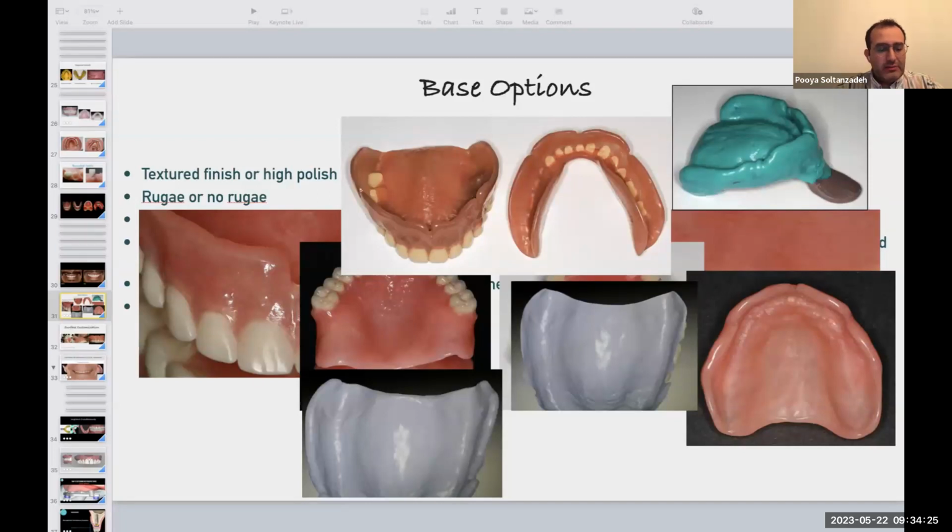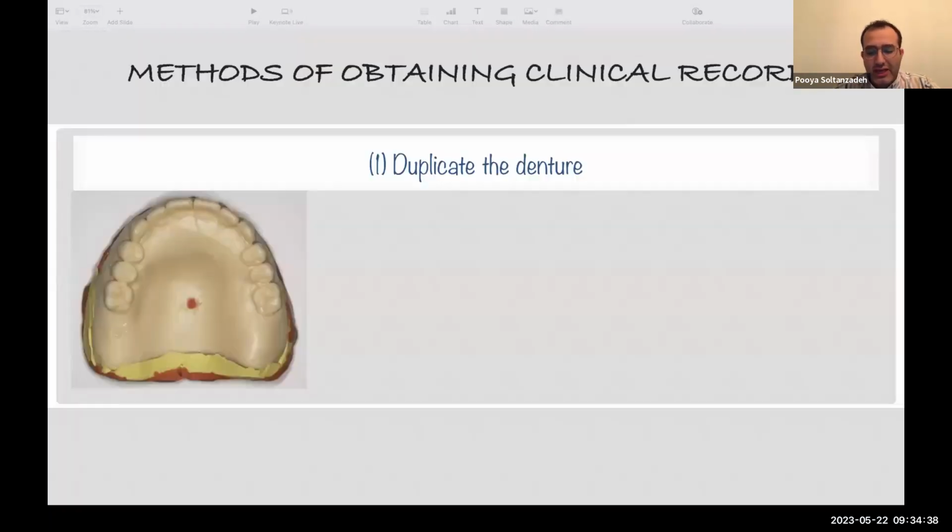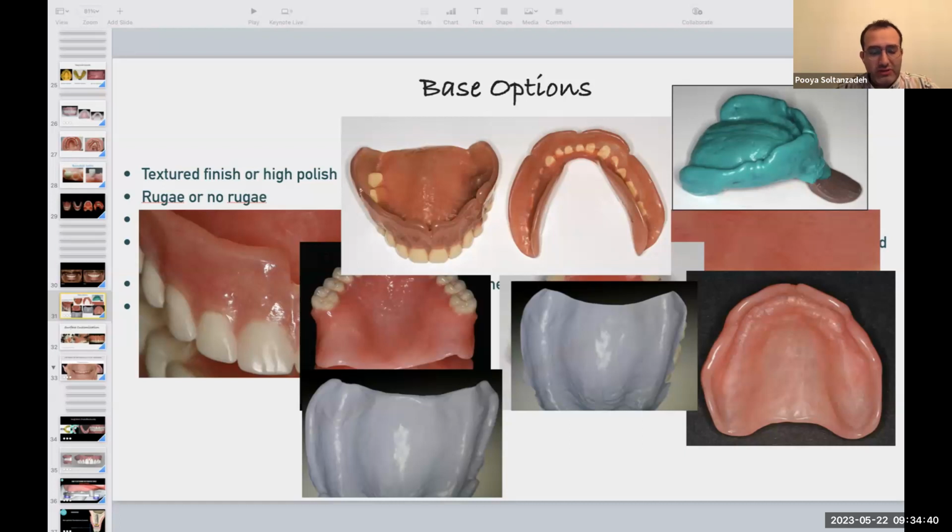And then you basically adjust it to the patient's mouth. It looks like a tray, but it's not a tray. It's like denture teeth. And then you do a wash reline, you do an impression with it, you treat it as a kind of tray. And then you do your bite registration, vertical dimension, everything off of that. And then you send it to them. And this is how it's going to look. And then they look at the interocclusal jaw record, the space and everything. They play with it. They send you the preview, and they will fabricate the final dentures. This is one way of making that.